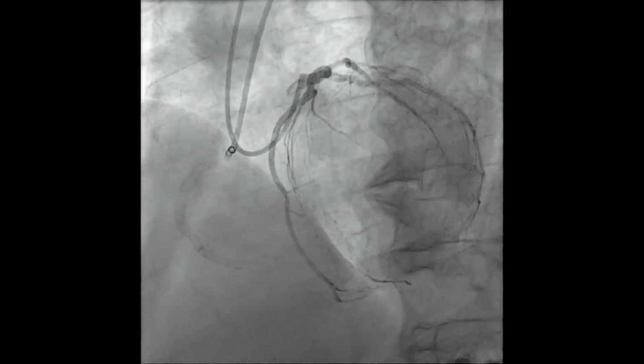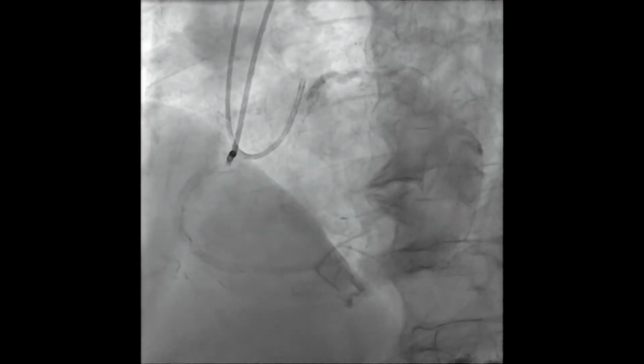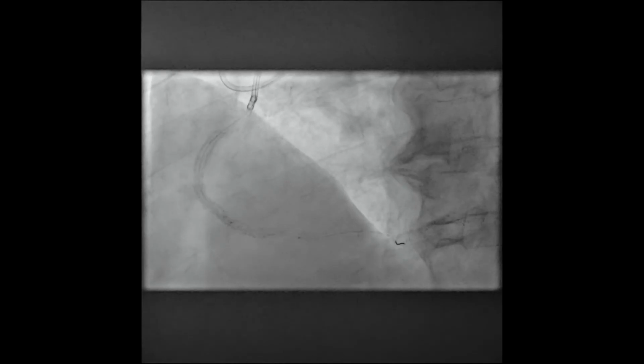So 78-year-old gentleman, history of RCA PCI, found to have a subtotal occlusion of his RCA, had scar with viability and 3 antianginals with ongoing symptoms, so came forward for PCI. And as we all know, underexpanded stents are terrible. So easily wired the vessel, performed balloon angioplasty with high pressure NC balloons in the US. We don't have OPN, so we're limited to what's on the shelf. Unfortunately, we had several segments of stent underexpansion.